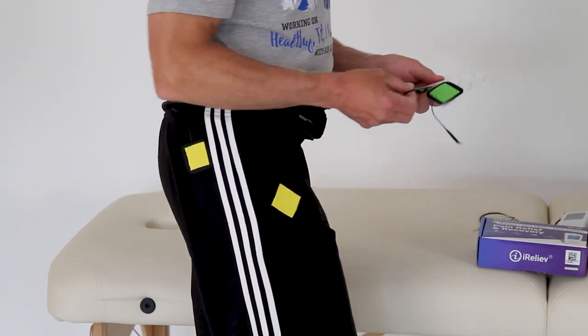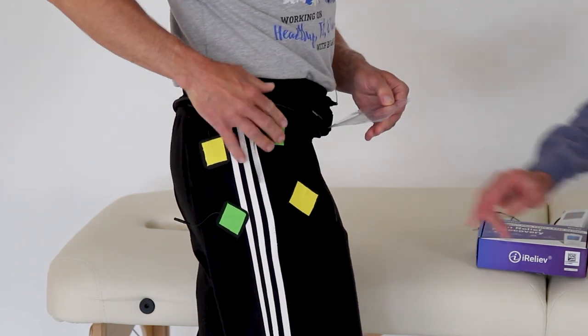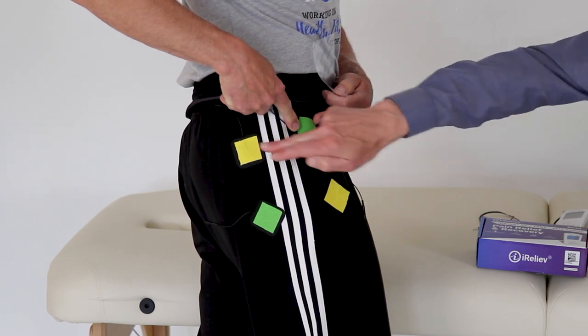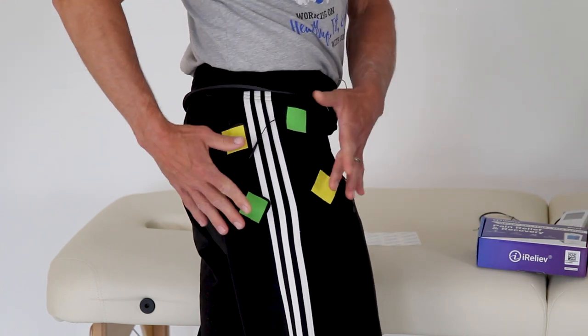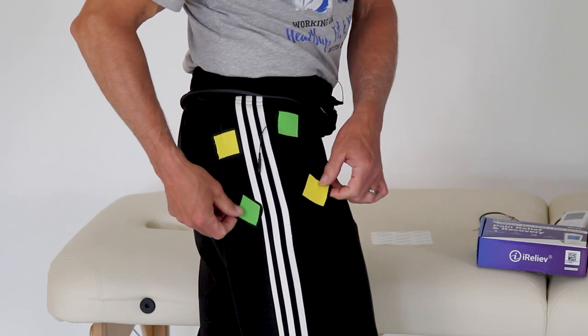You'll see why it's important to have the channels correct here, because the current is going to run between channel one and between channel two. So it forms an X. Now you're going to energize all four electrodes and see how it works.